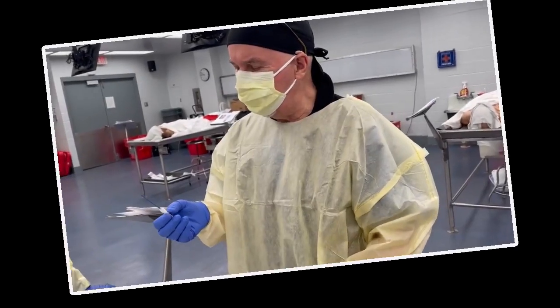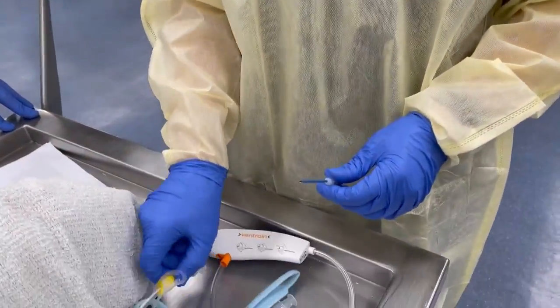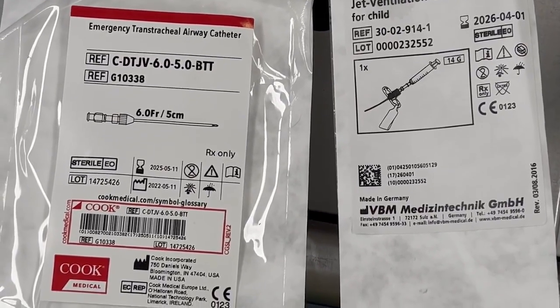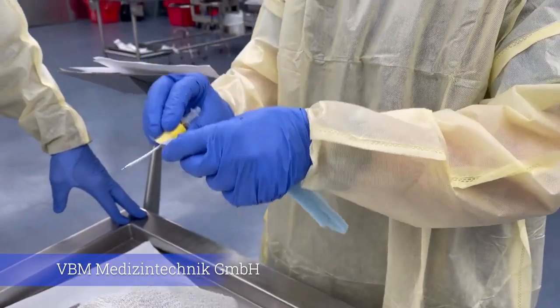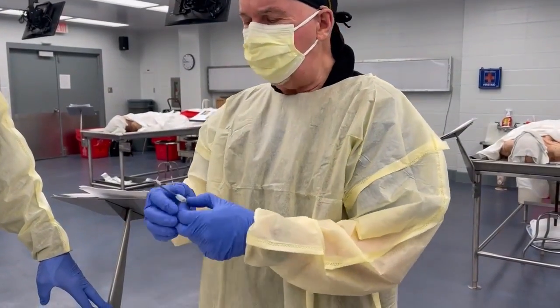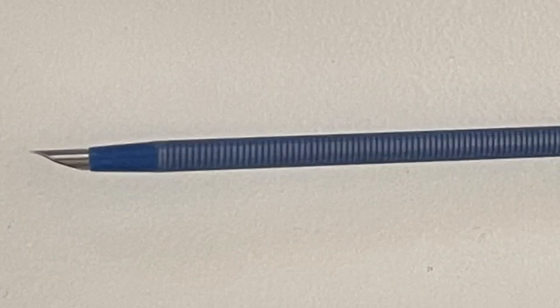I have a Cook transtracheal jet ventilation needle. There's also another needle from a different company where you can actually tie it onto the patient. This is a perfect size for a pediatric patient; this one is okay for a larger pediatric patient. The value is that it's stiff — it won't bend.